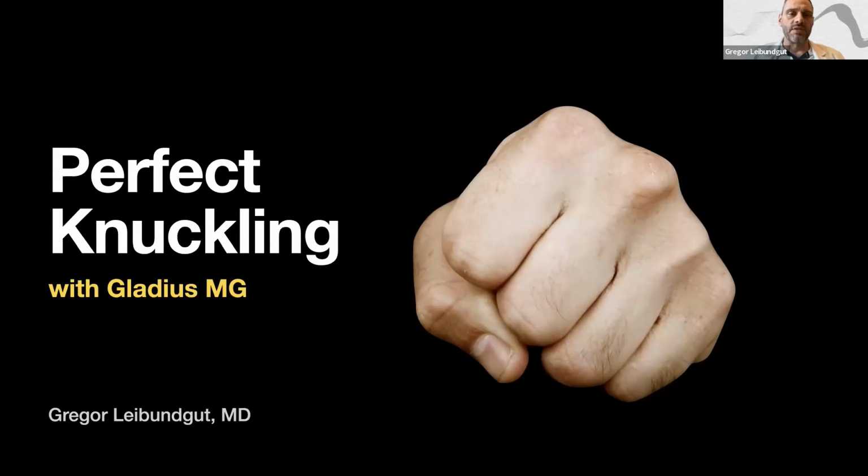And that brings me to my talk today about perfect knuckling with the Gladius MG, which is an extension of the Gladius X, which was the initial Gladius, which is, I think, an improvement over a Pilot 200 with a pre-shaped tip, a little bit different tip load. And now, you mentioned it, Bill Lombardi invented the Gladius Mongo, how it's called in the US and in Europe, and I think the rest of the world would call it MG. It's a little bit of a different Gladius wire, and I think it's also a game changer in some sort, like the Suo.